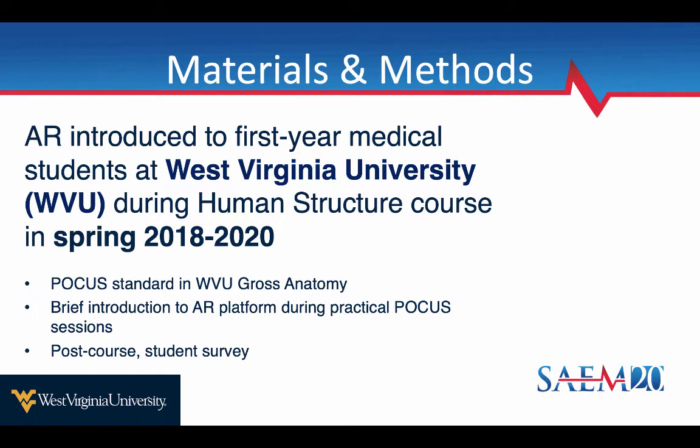So just to go a little bit into the methods of the study we performed to help us evaluate the utility of the technology, our medical students, starting in first year, do ultrasound, starting in gross anatomy and all through the medical school curriculum. And in the last couple of years, we introduced the augmented reality platform into that training. We gave them some brief introduction to the platform, showed them how to use it, gave them some experience looking at the different views during our other ultrasound hands-on sessions, and then we allowed them to practice and gave them access to the technology outside of class on their own time.